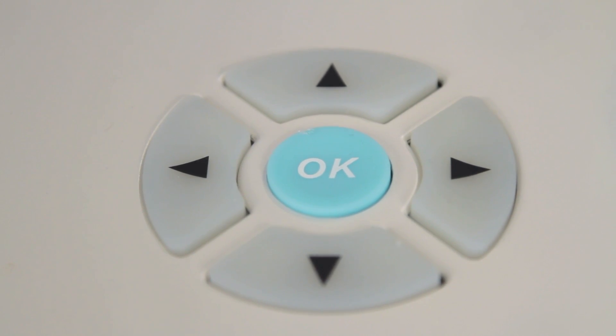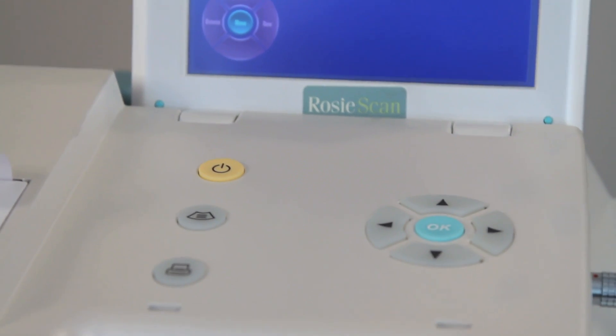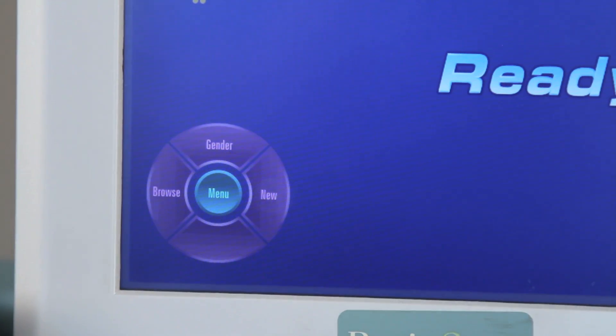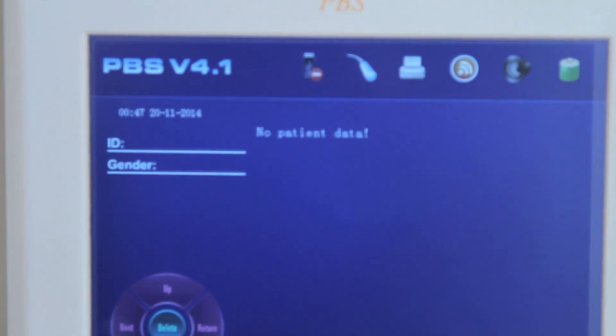You will find two sets of navigation keys: one set on the Ready screen called Functional keys, and one set on the control panel called Directional keys. Press the right directional key or touch the New functional key on the Ready screen to delete the max tested volume without switching off the device. Press the left directional key or touch the Browse functional key to browse previously saved readings.